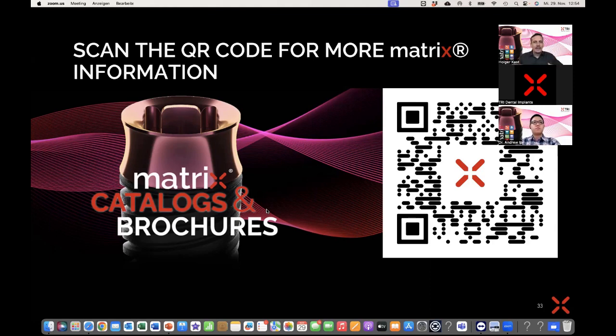But this is the developing what happens right now a lot. There's a lot of materials in the market which can be printed, and you have to make sure that your printer is able to use the material you want to use. There are printers that can print 20, 30 different materials. Other printers can't print too many different materials. So this is important to take care before you make the choice of printing.